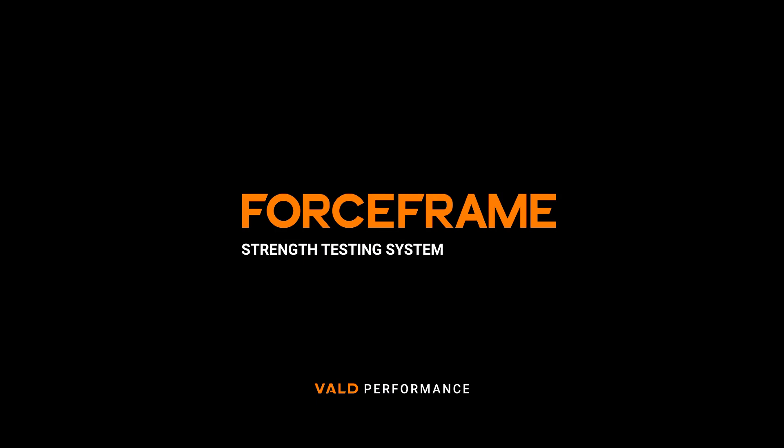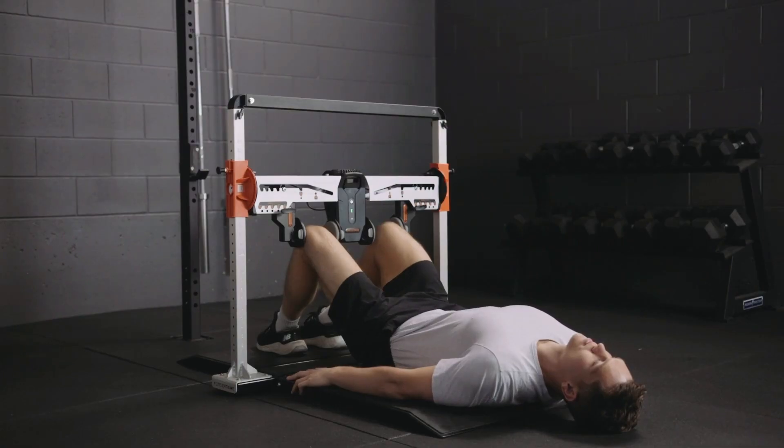Today we're going to focus on measuring isometric adductor and abductor strength using Vald Performance's force frame. The force frame enables a whole host of testing positions to be used, and in this video I'm going to focus on what is probably the most common — adductor and abductor testing in a supine position with a bent knee.